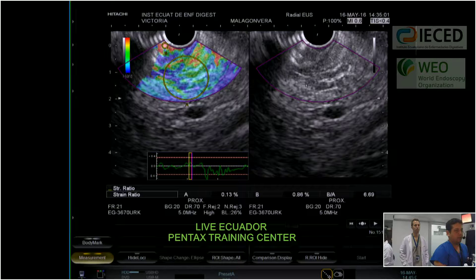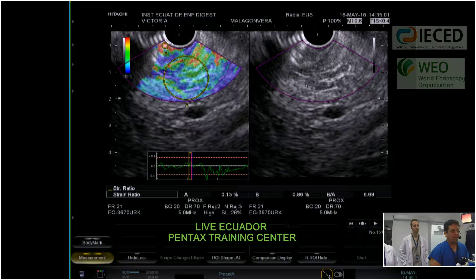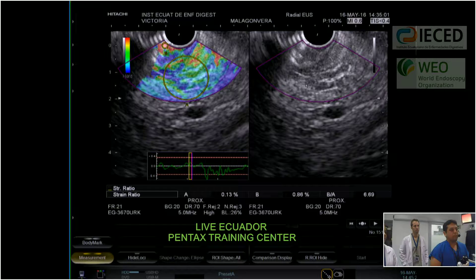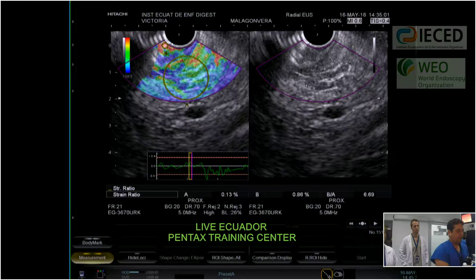Without any other anatomical alteration on endoscopic ultrasound B-mode, these hyperechoic spots inside the pancreas could represent a suspicion of chronic inflammation of the pancreas, which could be reflected by the symptoms of the patient — the epigastric pain and elevation of these laboratory parameters.